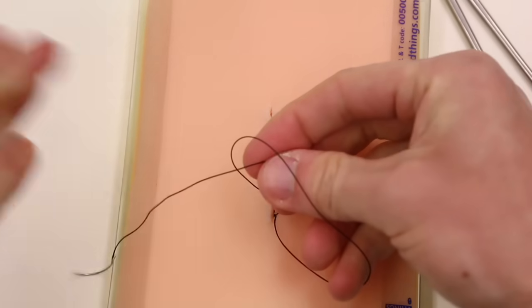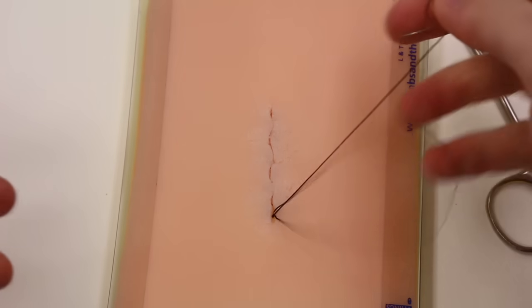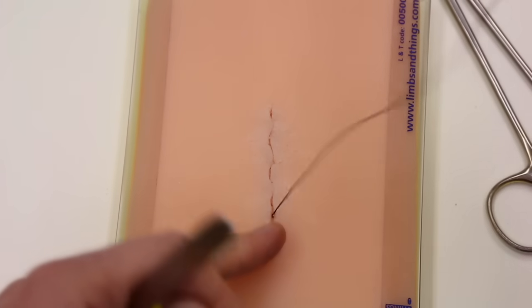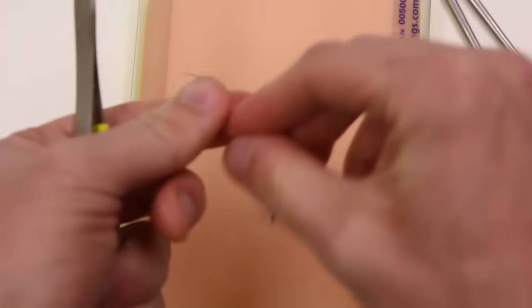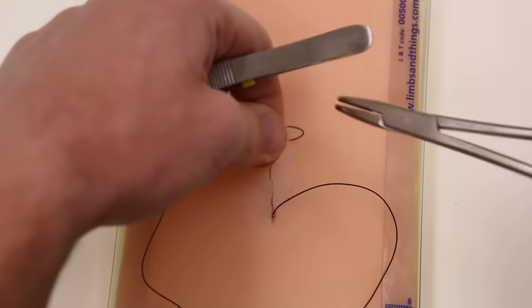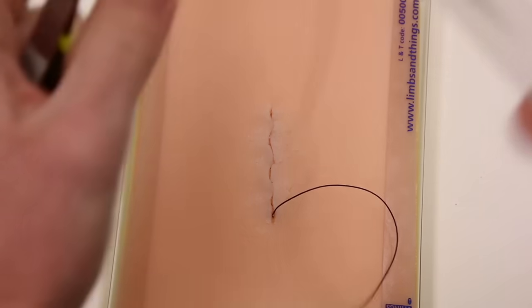Now, pull the needle through first, then let the knot tighten. Because if the needle hooks on the other side, you end up flailing around a bit and it looks silly.